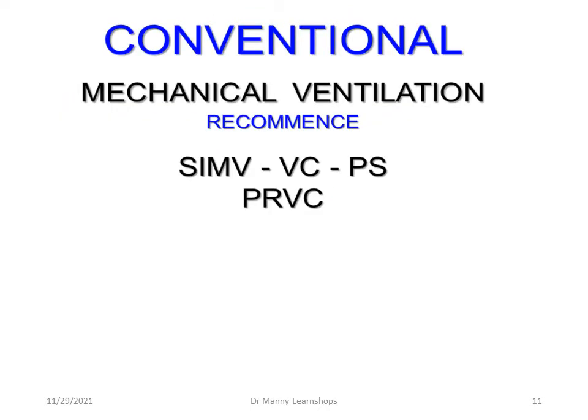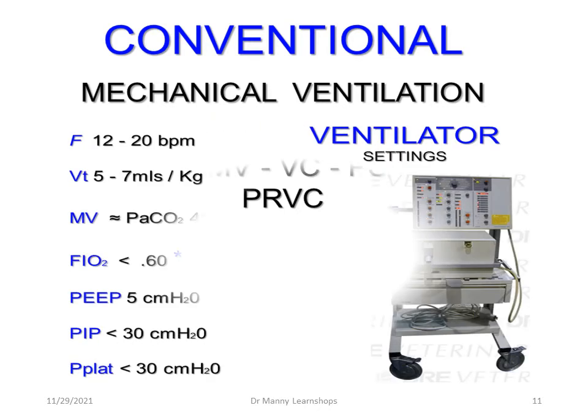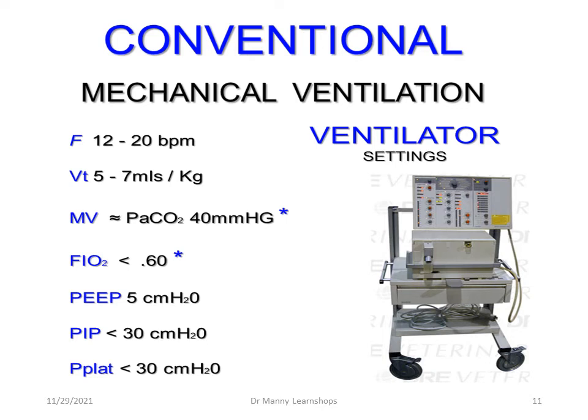When it comes to conventional mechanical ventilation, recommence depending on the mode. Now the physician will order the mode. I've just put here synchronized intermittent mandatory ventilation, whether it's volume control with pressure support or pressure regulated volume control. And typically the ventilator settings would be a frequency or rate of 12 to 20 breaths per minute, tidal volume 5 to 7 mils per kg, a minute ventilation with a PaCO2 of 40 millimeters of mercury, FiO2 less than 60, PEEP 5, peak inspiratory pressure less than 30, and peak plateau less than 30 centimeters of water.